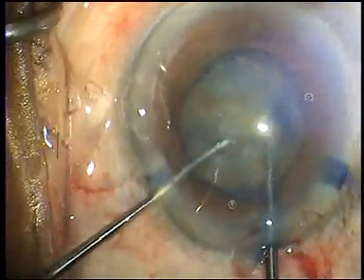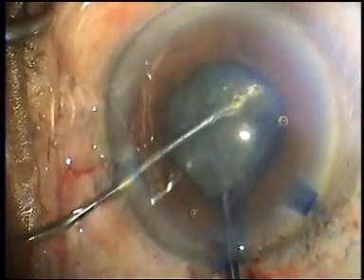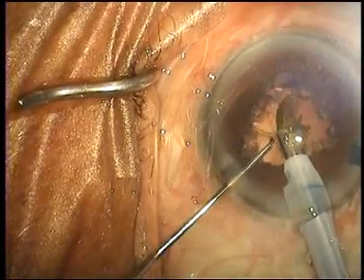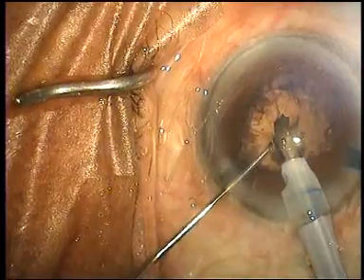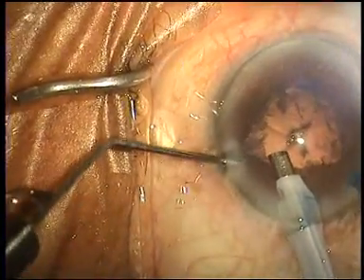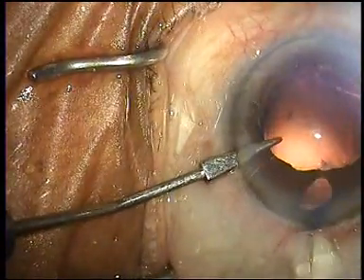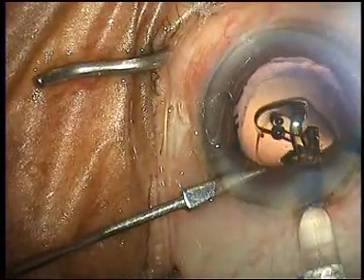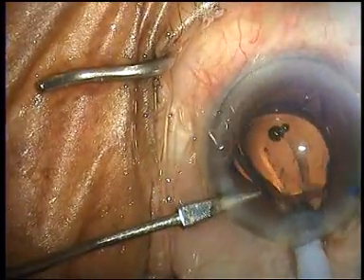A bimanual nuclear rotation is now carried out and you can see that the nucleus is rotating easily, safely, and effectively within the bag. After the phaco is over, the eye is again stabilized with the eye lock and the lens is inserted easily into the capsular bag.